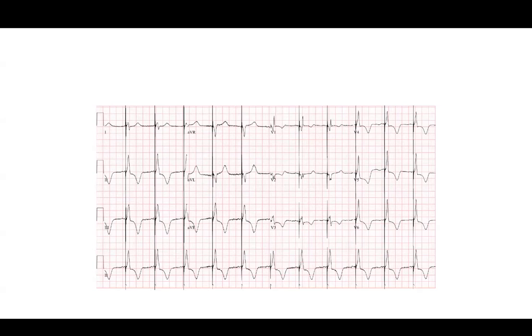but when the ring is deep in the septum and you pace bipolar, you can actually capture kind of both sides of the septum, and a backward capture to the right bundle, and have a narrower QRS. That's kind of a new concept of, you're not selective, non-selective, you're biceptal, and you recruit more of the conduction system that's left in the patient.